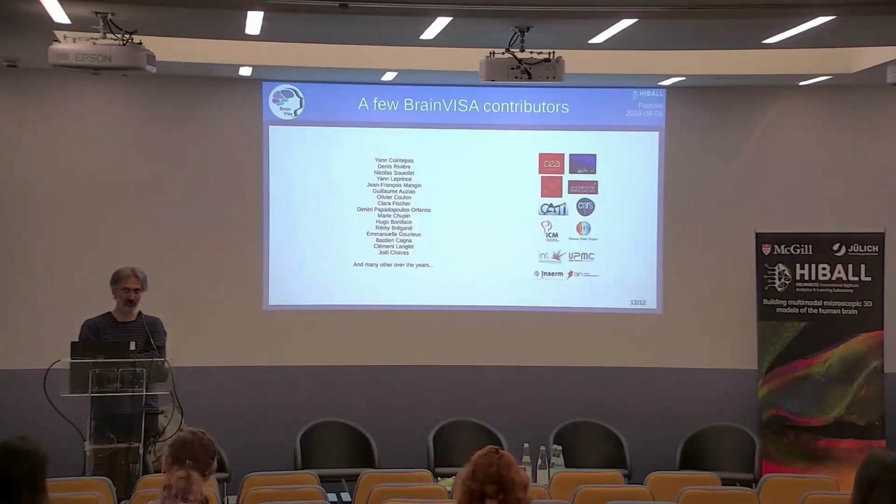It can process images of higher resolution. We sometimes process images of about 0.5 millimeter resolution. It works, but it's not optimal. It takes far longer because the images are 8 times bigger.